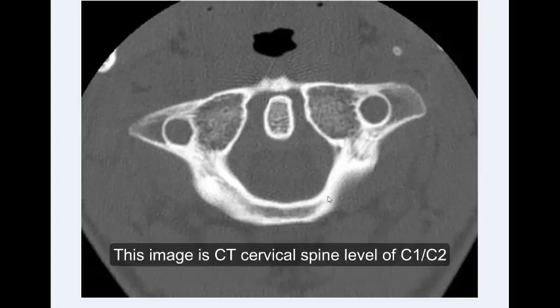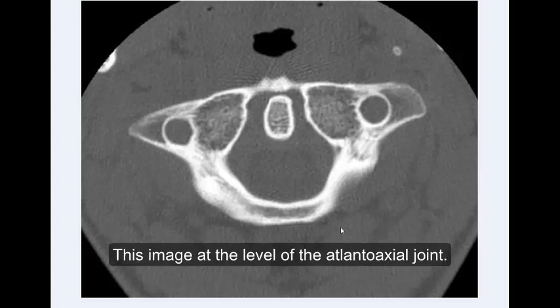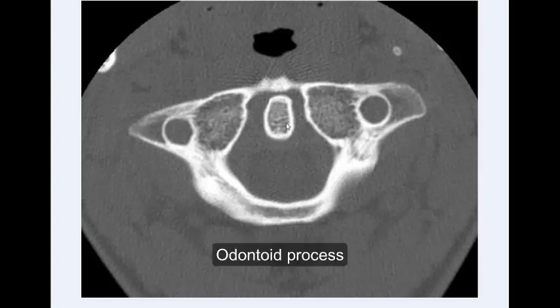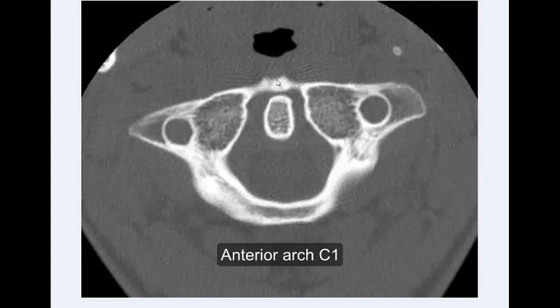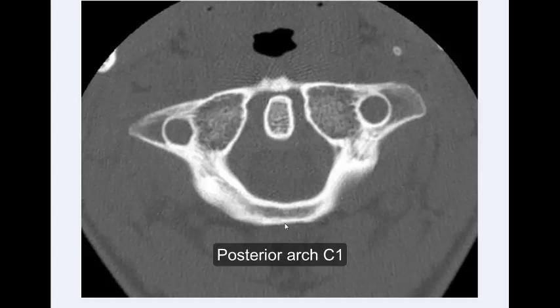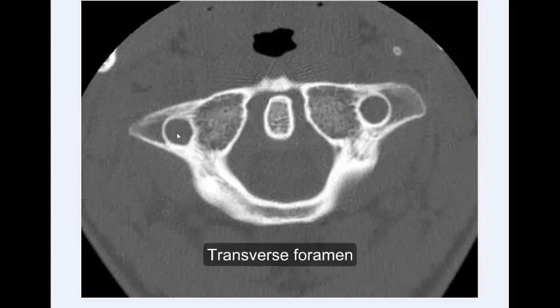This image is CT cervical spine at the level of C1 and C2. This image is at the level of the atlantoaxial joint. We can identify the odontoid process of C2, the anterior arch of C1, the posterior arch of C1, the lateral mass of C1, the transverse foramen, and the transverse process.